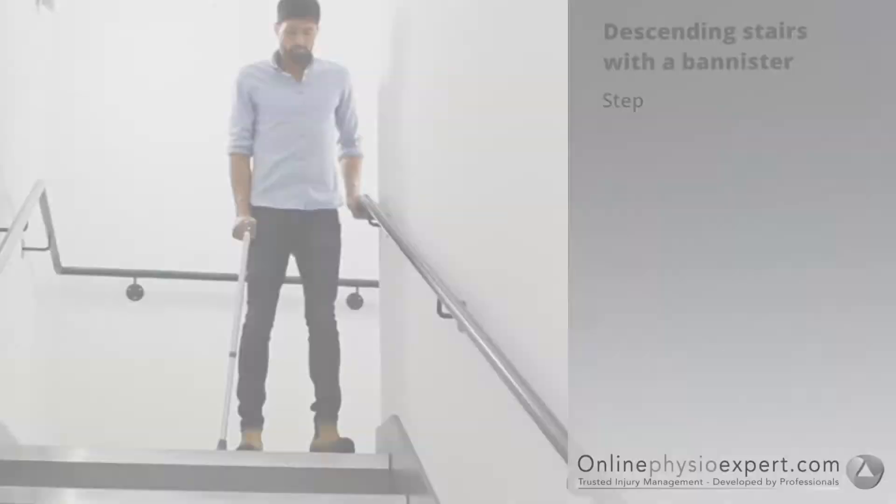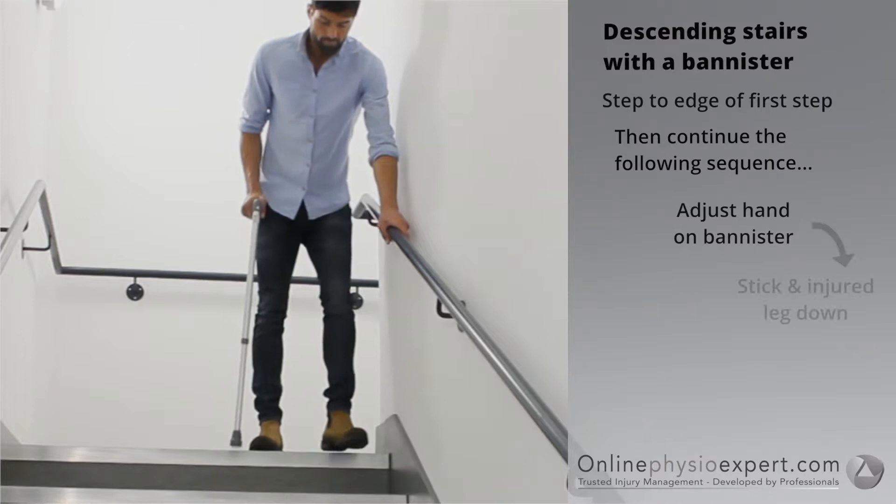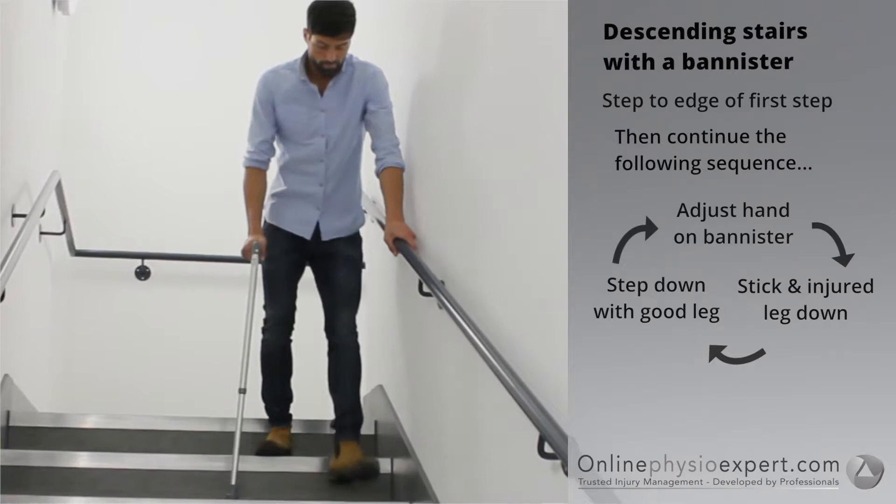To descend stairs safely, step your feet to the edge of the first step. Place your hand forwards on the banister. Place your injured leg and stick down to the next step, followed by your non-injured leg. Repeat these sequence of movements until you safely reach the landing.